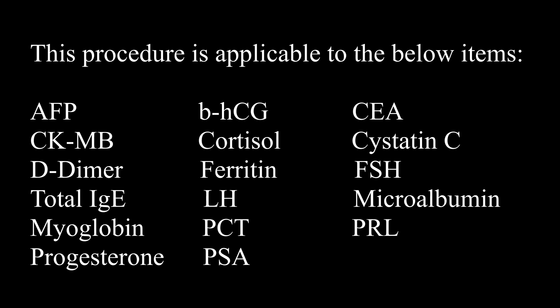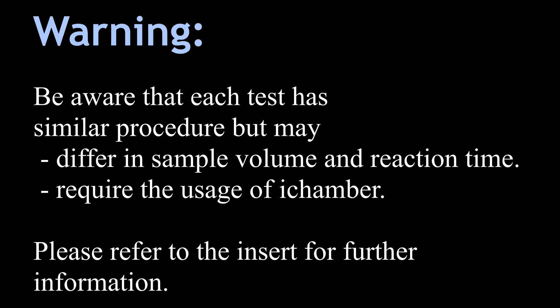iChroma Standard Procedure 2 Video. This procedure is applicable to all the shown items. Each test has a similar procedure but may differ in sample volume and reaction time.